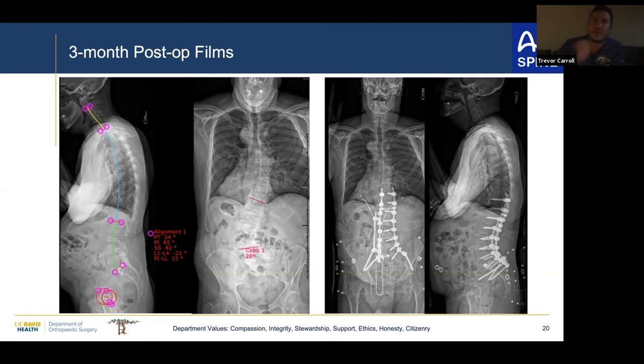It's more like a flat back deformity than a scoliosis, but you'll use the L5-S1 for an ALIF. It's more to get the sagittal balance correction on something that has a prior fusion. It's not so much to get a fusion rate. I don't think we've got problems, but fusion's not one of them, usually. Well, like everything, if you follow them out long enough, you can find problems.